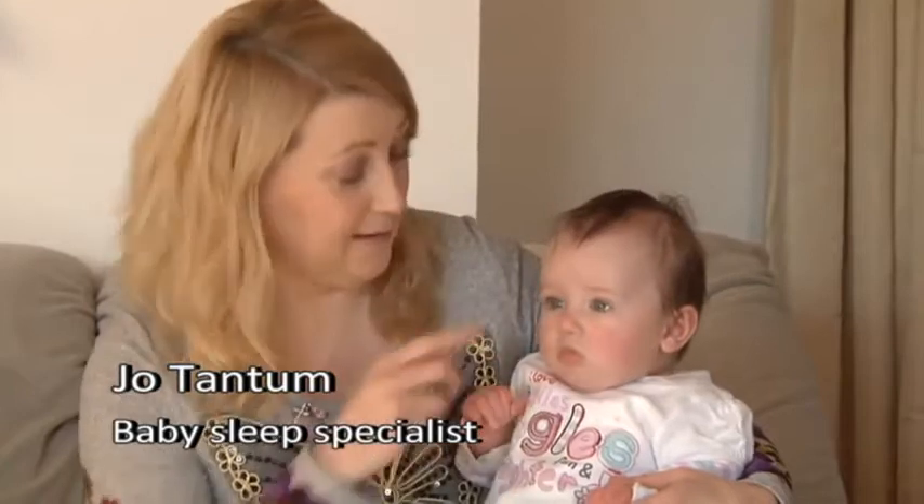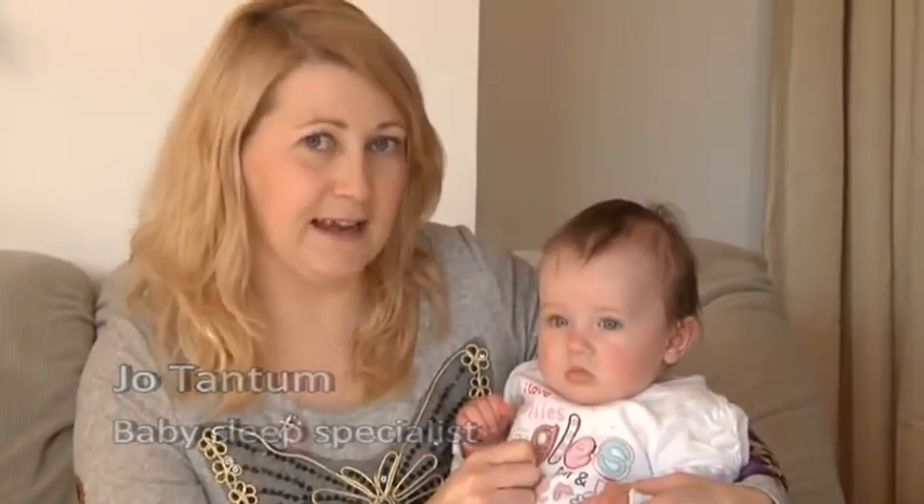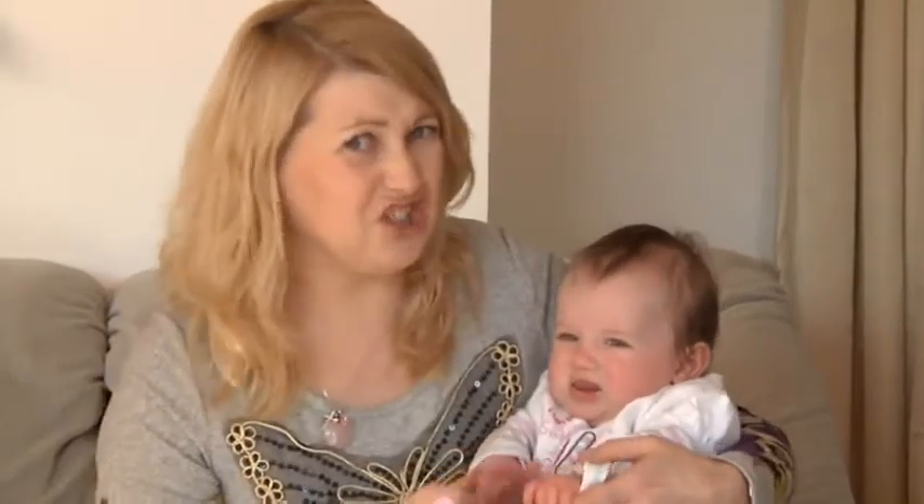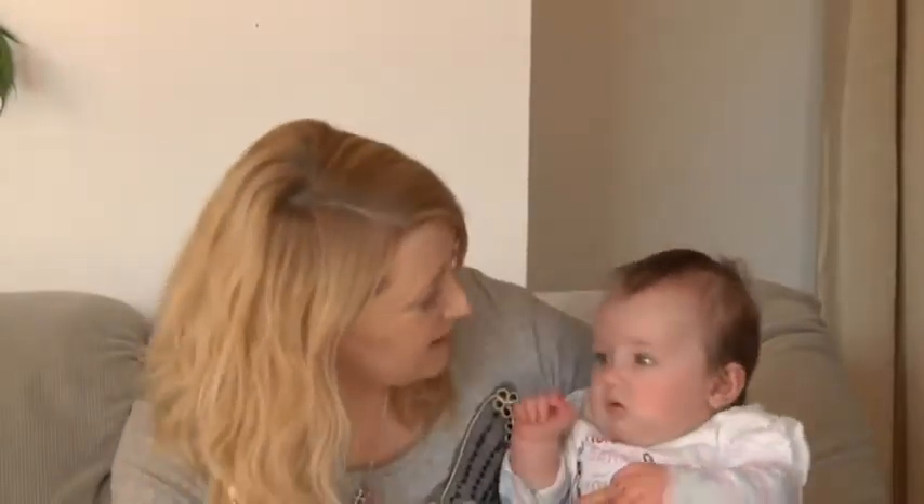We're going to sort Ava's dirty, snotty nose out in a moment with the Baby Nose Clear nasal aspirator. As you can see, she's not particularly happy because she's hungry and she can't have anything to eat because she can't breathe — she's all blocked up. Don't worry, Ava, we're going to sort it out.